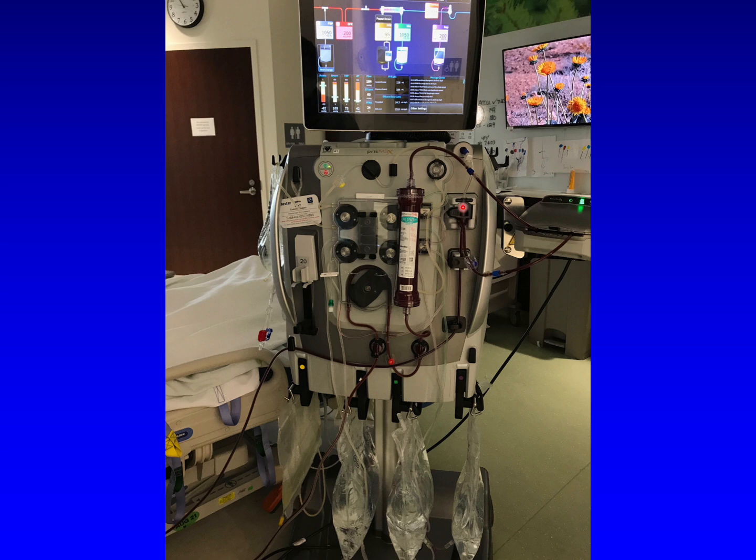And if you're adding the dialysis component in CVVH-DF, dialysate is also infused through the canister, so it flows past the fibers to pick up more molecules. And so the effluent in this bag is going to contain not only the ultrafiltered fluid that was sucked through the capillaries, but the used dialysate, which now contains the molecules of stuff picked up by diffusion as it flows past the capillaries. The screen at the top of the machine lays it all out schematically, so let's look at that.